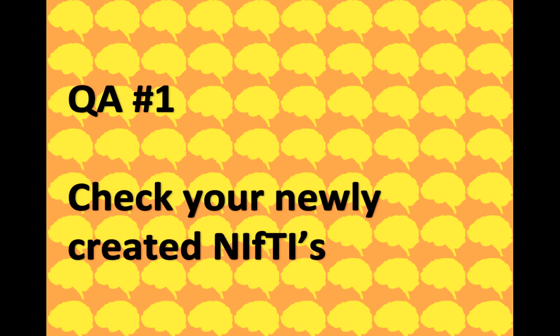All right, welcome to the first video in the FSL tutorial series. So this is the first quality assurance, or QA, step that you'll be applying, and I'm assuming you've already converted your data from DICOM to NIfTI format.